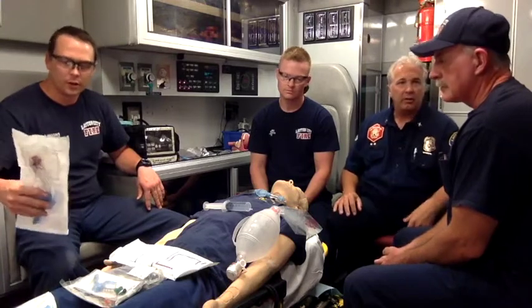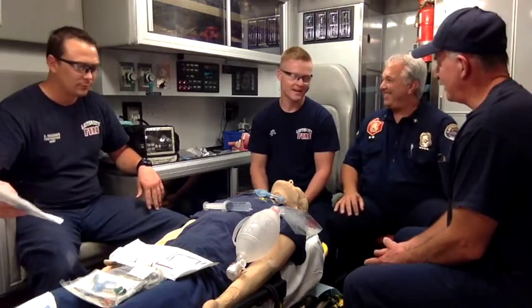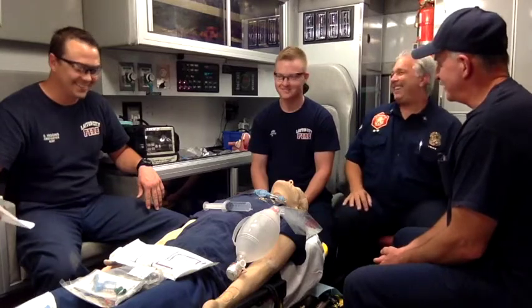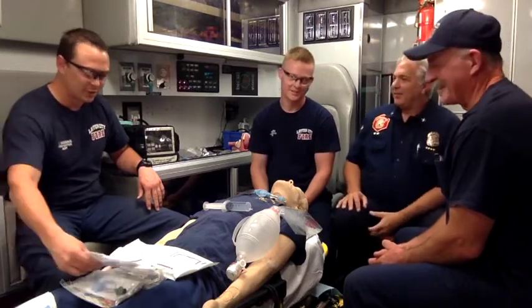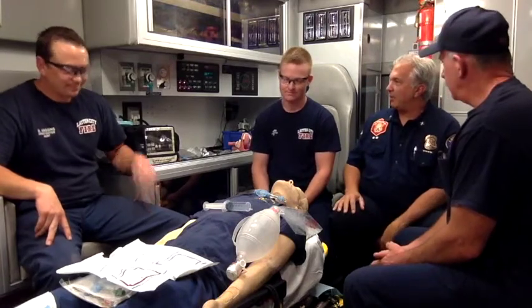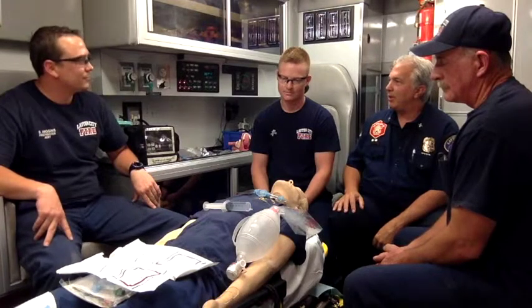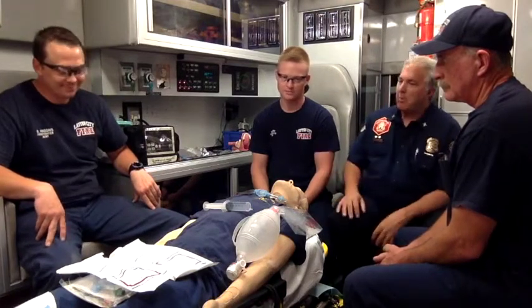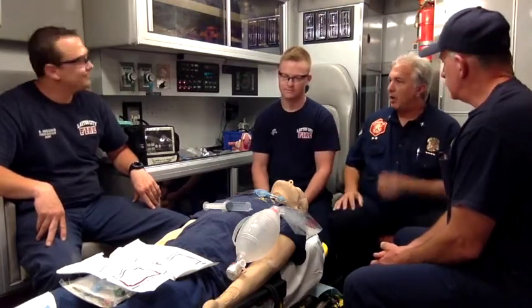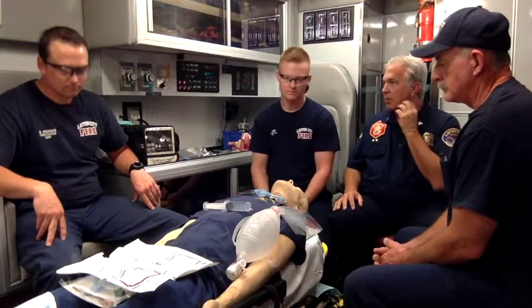How tall are you? According to their sizings, it'd be 5'10". You're only 5'10". I figured 6'2". A 4 is recommended at 5'10". It's going to be a number 5 then. So Dion and Ben DeJean are about the only ones on the department who are going to get the 5. Who else am I thinking about? Anybody else? Big tall guys? Braden, yeah, probably. But most adults, male and female, I think the 4 is going to be the one that works.